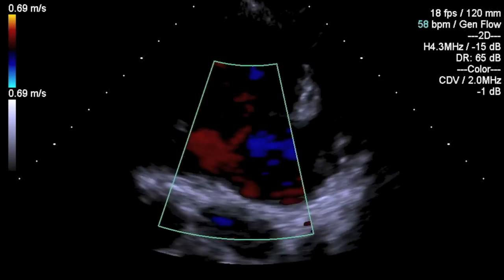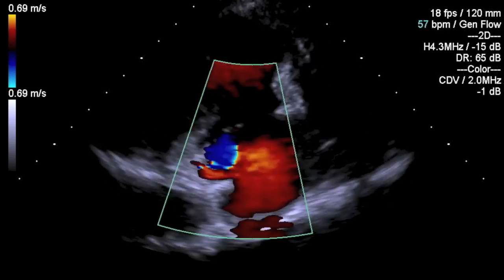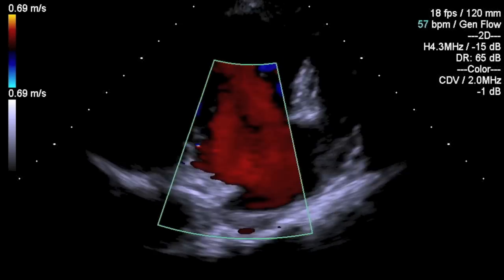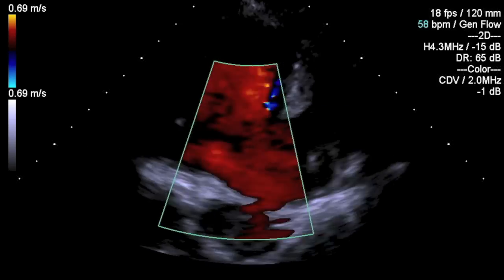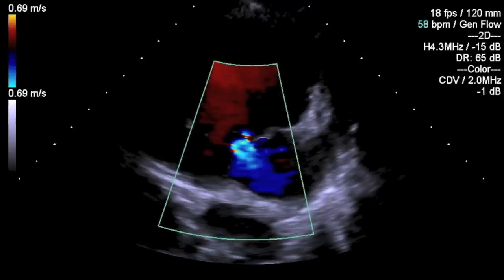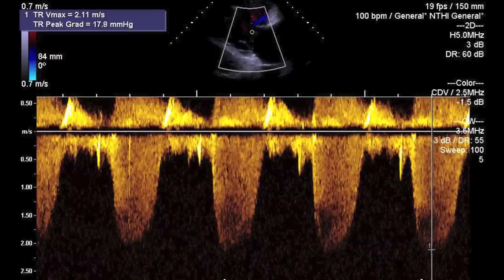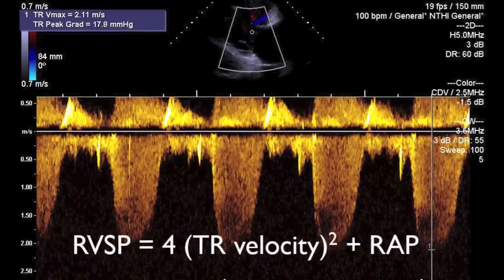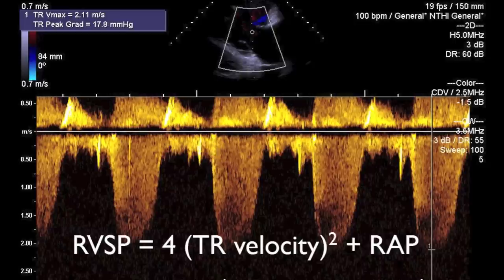If there is any gross valvular regurgitation, try to align a continuous wave Doppler parallel to the jet direction to make an assessment of the velocity. By applying the modified Bernoulli equation, you can estimate the pressure gradient between the right atrium and the right ventricle. Adding the right atrial pressure will give you an estimate of the right ventricular systolic pressure, which is equivalent to the pulmonary systolic pressure.